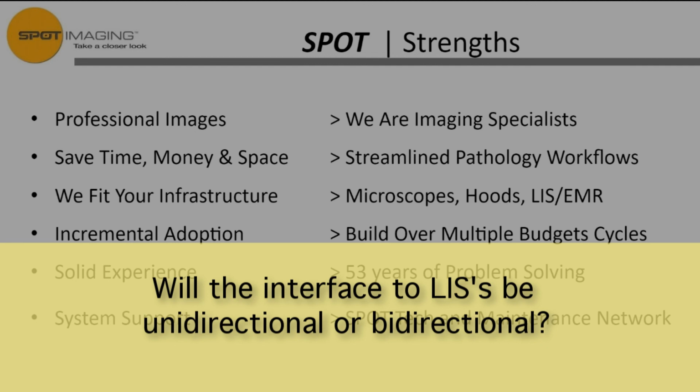But as we work with the different labs and they come up with useful features that might require other data to be presented on our screen, we would hope to be able to make an HL7 message requesting data from the LIS and presenting it to the user at the screen.